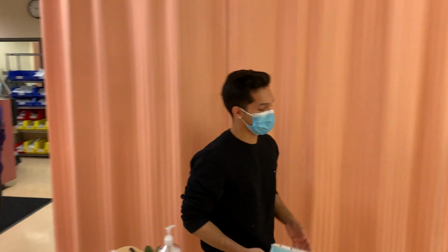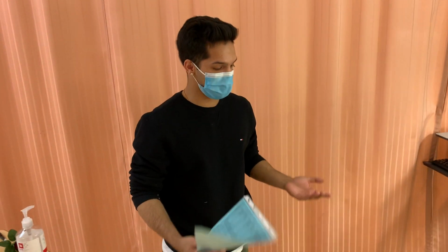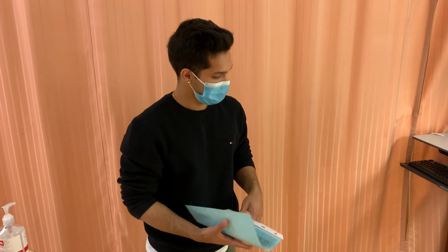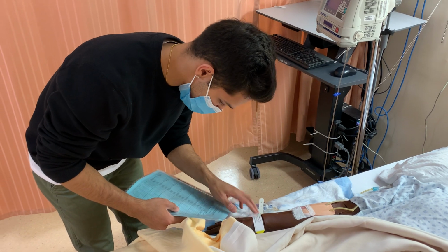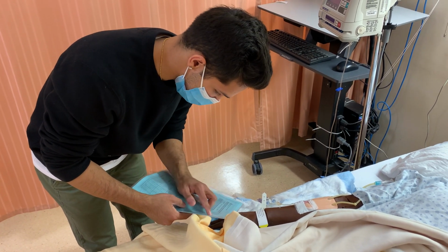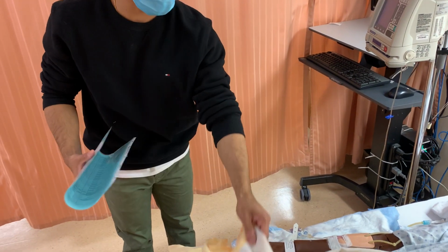Hi, my name is Mohit Kaushal. I'm going to be your student nurse today, and I'm from the University of Manitoba. Before I start, can you verify your ID with your armband? Okay, perfect. Bryson Scotland, Finn is 123, 123, 456, 456, 79, 79. Could you please tell me your full name and date of birth? Okay, the patient has confirmed their identity.